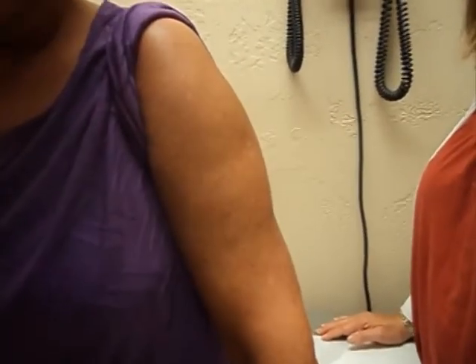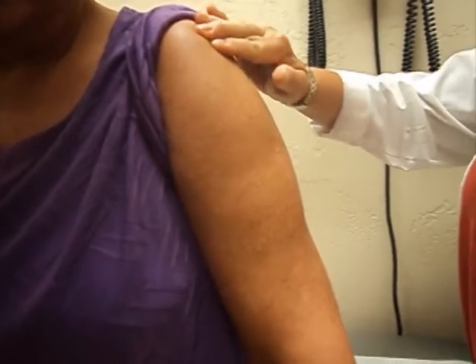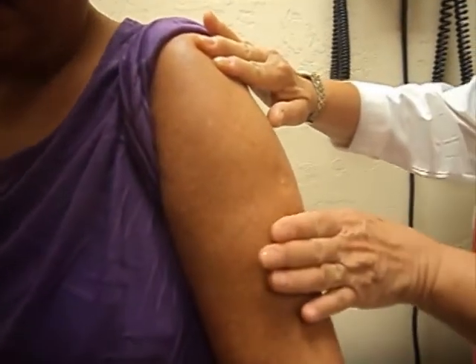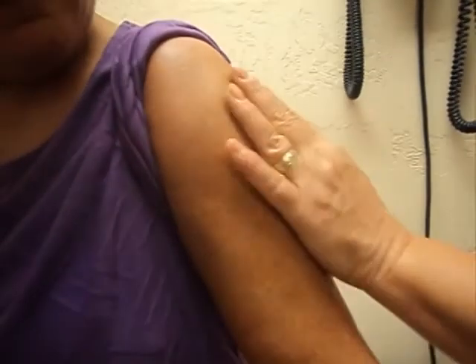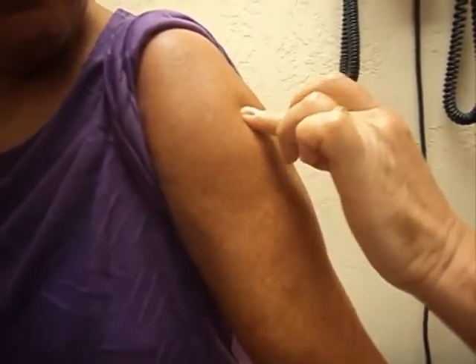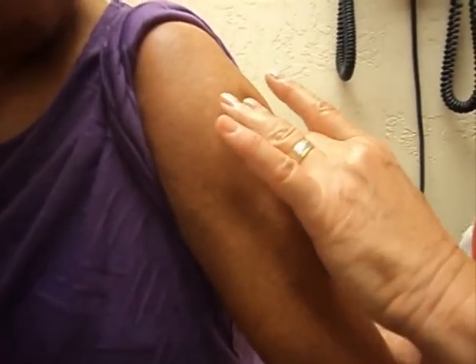In an arm injection, it's almost the same thing. You put 2 fingers on the bone, which is the shoulder, that you can feel the articulation there, and probably a hand around the elbow, and again you have this area where there's a muscle. You flex your arm. Again, you can see it when someone flexes, and I would pick the spot right here. As I can tell, it's a great site. When you give injections, you're going to have people relax, though.